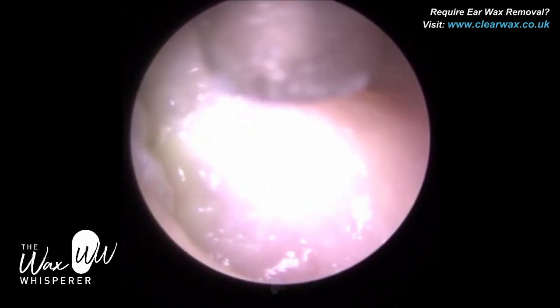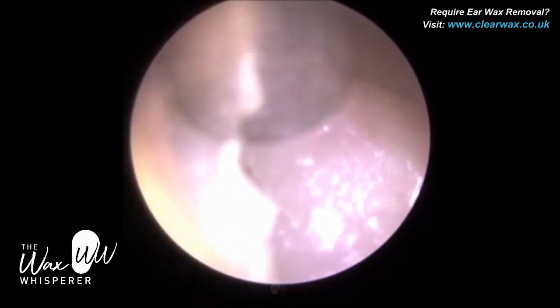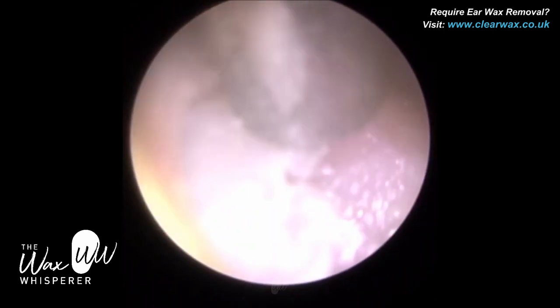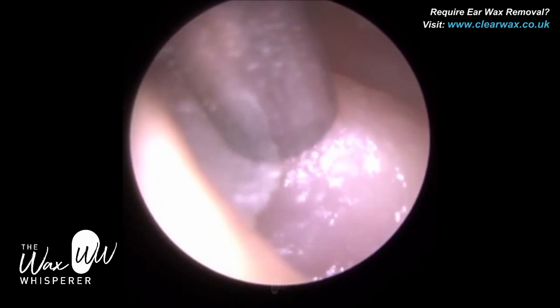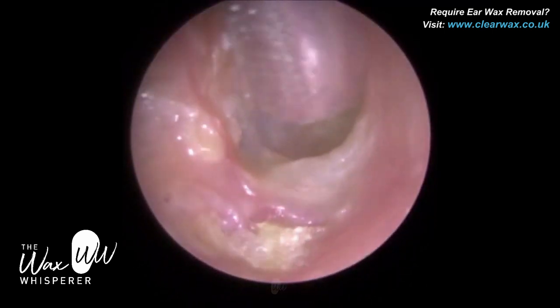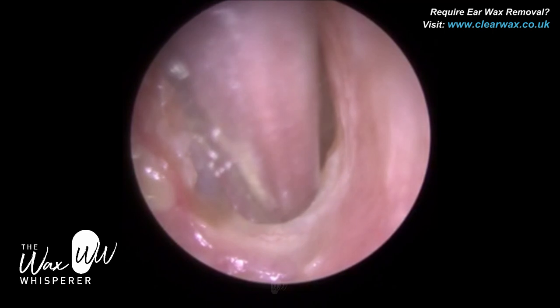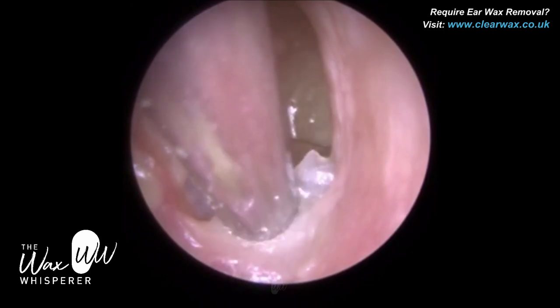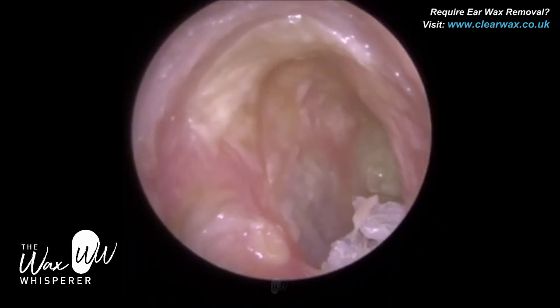We are literally just into the entrance of the ear canal on the rear, and there's a little crater here. This patient had previously developed a canal cholesteatoma. A canal cholesteatoma is when you get a buildup of dead keratin skin, typically in a crater like this. This skin doesn't migrate — it collects, gets hard, gets infected, and starts eroding the ear canal and surrounding structures. It can be very dangerous, almost life-threatening. For this reason, this patient uses sodium bicarbonate drops on a regular basis to help soften any dead keratin.